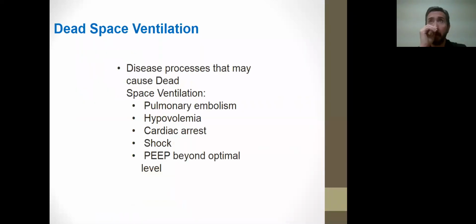All right. Now, dead space ventilation. Again, this is more in terms of our respiratory monitoring as well. Dead space is the volume of a breath that does not participate in gas exchange. It's ventilation without perfusion. In short, anything that causes a significant drop in blood flow, such as these diseases listed, or even using positive end expiratory pressure beyond the optimal levels. Okay.